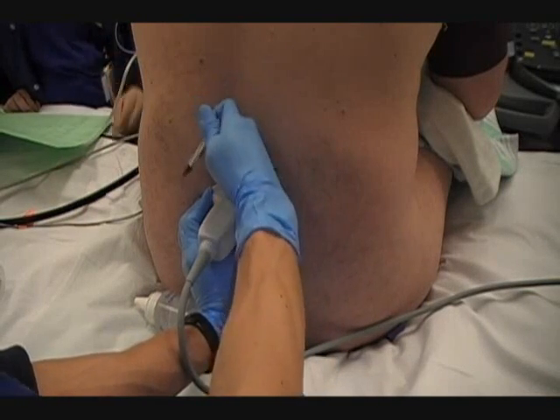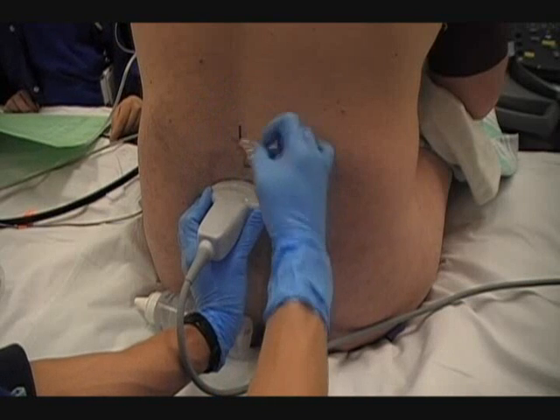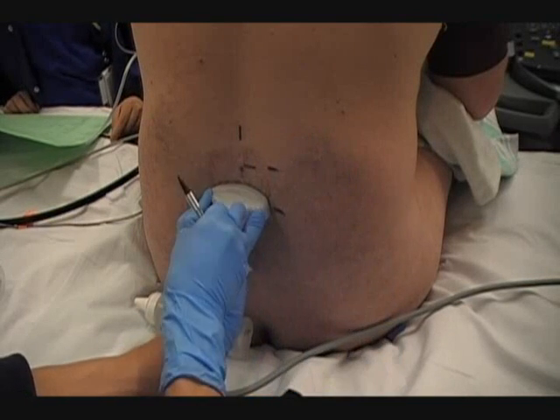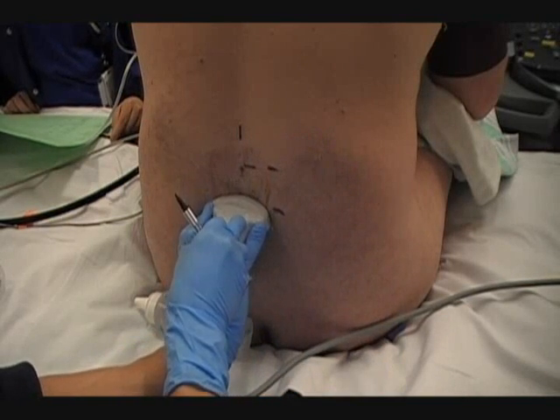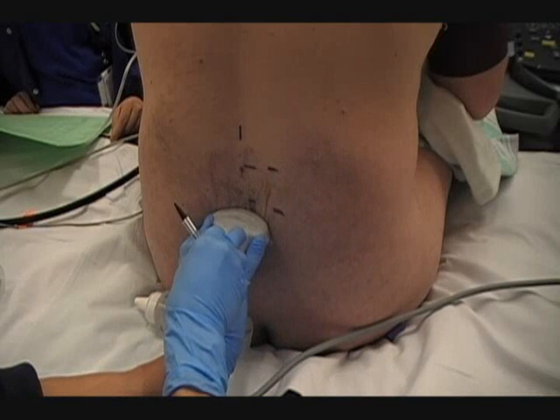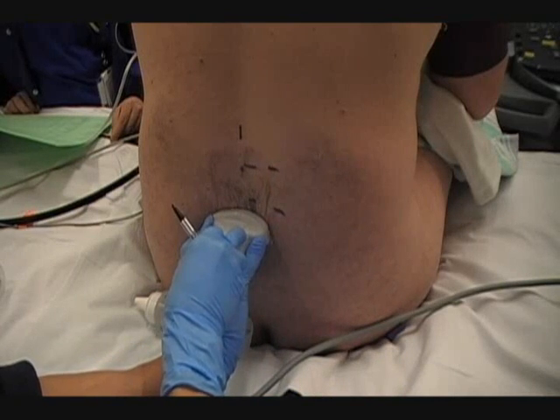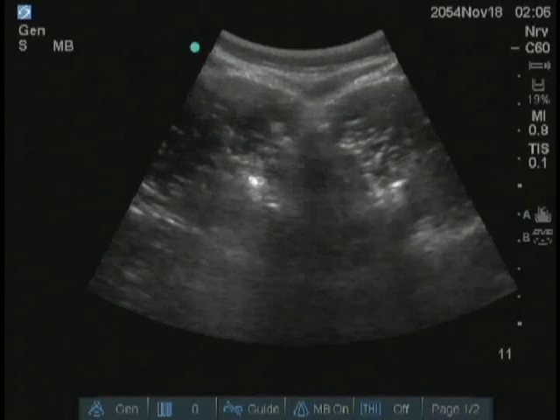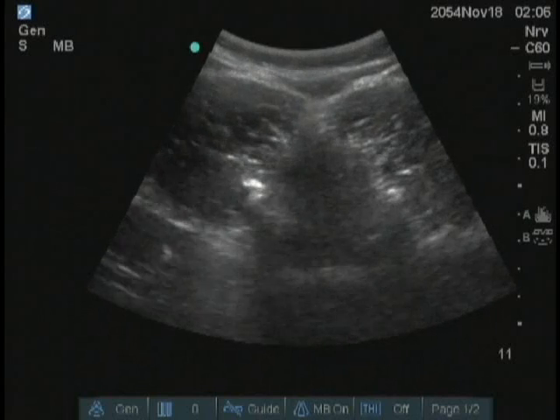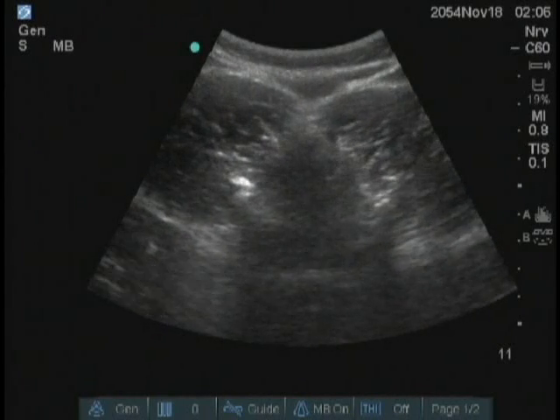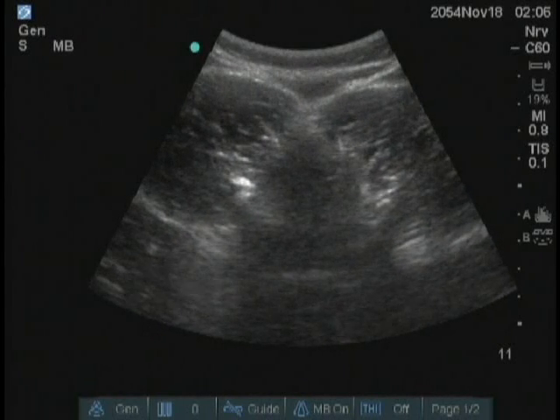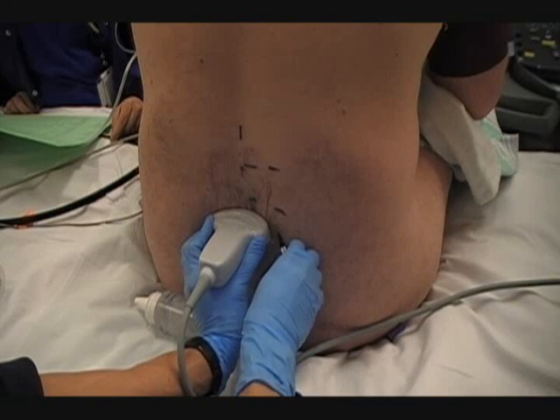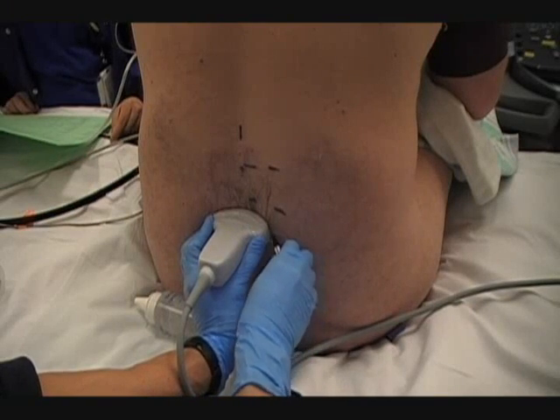Each intervertebral space may be scanned and marked in the same fashion. Note that the posterior complex of ligamentum flavum, epidural space and dura mater is usually less clearly visualized in the transverse view compared to the paramedian sagittal oblique view. Occasionally it may not be visible at all. What is most important, however, is to visualize the anterior complex of posterior vertebral body and posterior longitudinal ligament, which will signify that the ultrasound beam is indeed penetrating the vertebral canal through the interlaminar window.